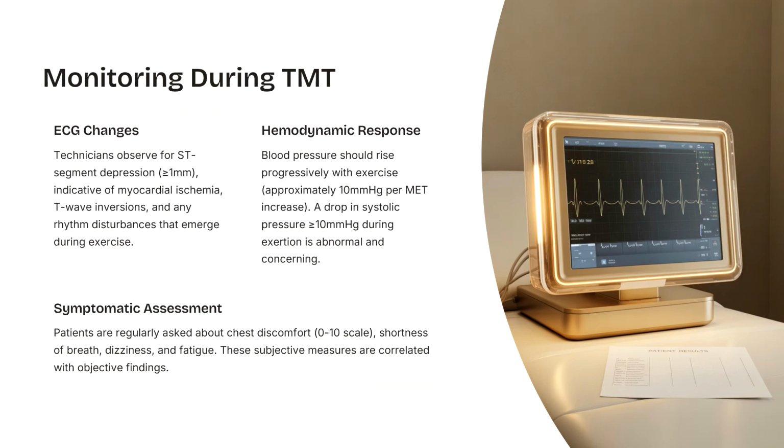Now, monitoring during TMT: what will we monitor while the TMT goes on? Number 1, ECG changes. Very important. Technicians observe the ST segment depression. This one is very important. ST segment depression greater than or equal to 1 mm is indicative of myocardial ischemia.